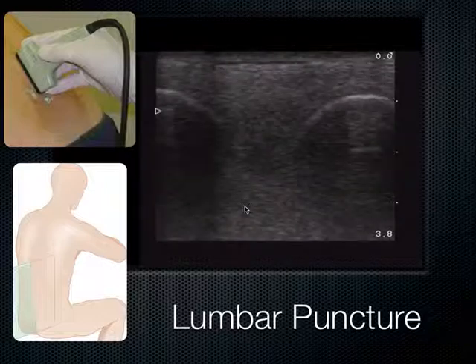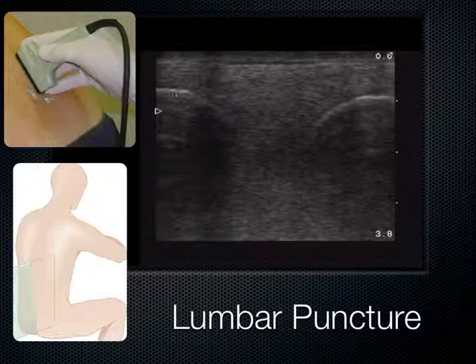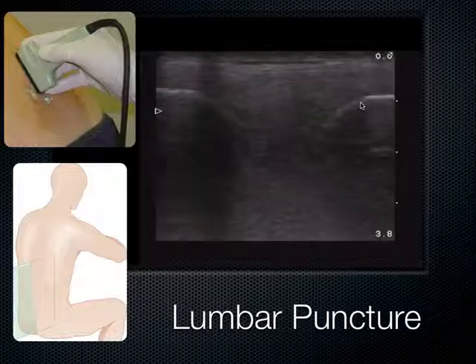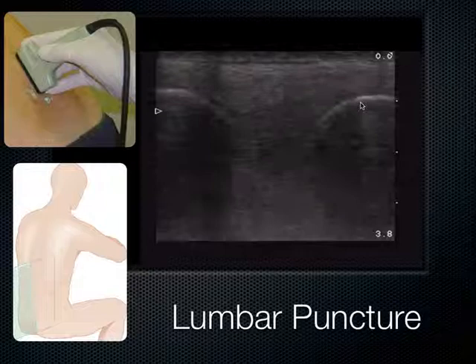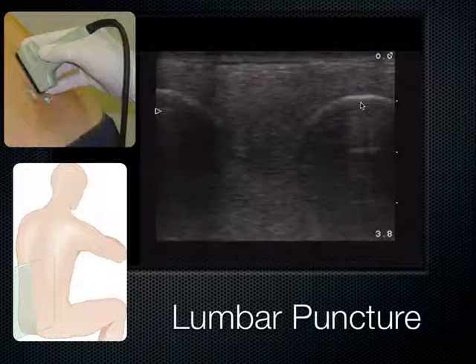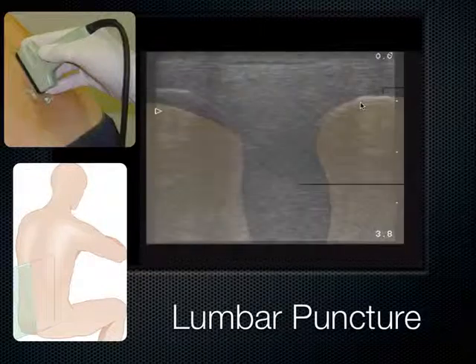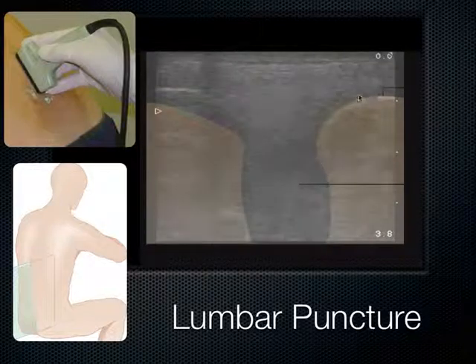But what you can do is use ultrasound to outline the landmarks of the transverse processes and then guide the needle between the landmarks into an X placed on the skin. My fellow from last year, Connie Chan, who many of you obviously know and remember, created a nice video on how to do this. And these are the intervertebral spinous processes seen here.